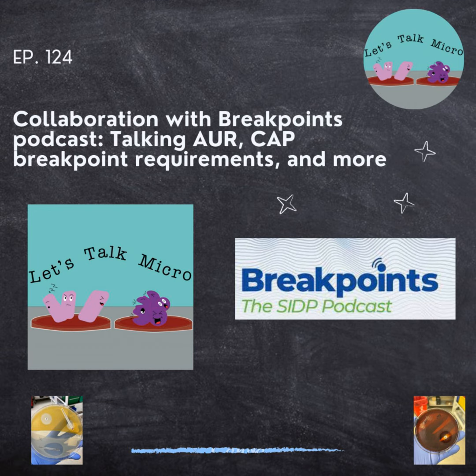So if you need to validate a new panel, you actually have to validate not only categorical agreement, you also have to validate essential agreement. So you have to validate the MIC distribution, the MIC agreement with the reference method. It's a whole panel. You know that the panel will be used against multiple isolates. Let's say the gram-negative panel for Enterobacterales and non-Enterobacterales. You have to have a series of organisms, a distribution between those organisms, and you start validating. You can validate as a whole panel what the essential agreement is, how many drug-bug combinations you have in agreement versus the reference. So it's a tedious and long process. But validating only a breakpoint is something that is not really common.